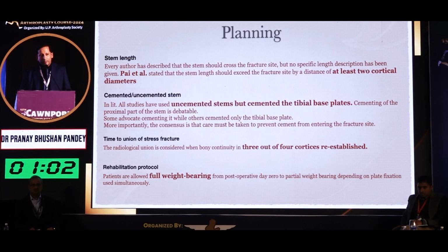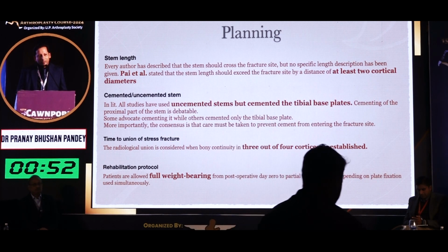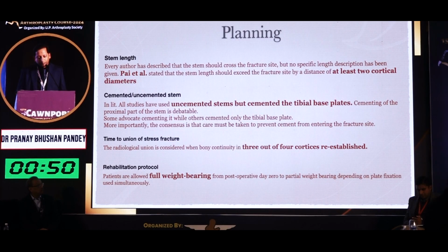Cemented versus uncemented stem. I saw some cemented stem also just now. So the general consensus is you have to keep the base plate cemented. You can keep the proximal part cemented. The stem is normally preferred as uncemented. And one thing is sure, that you cannot have cement around the fracture area.